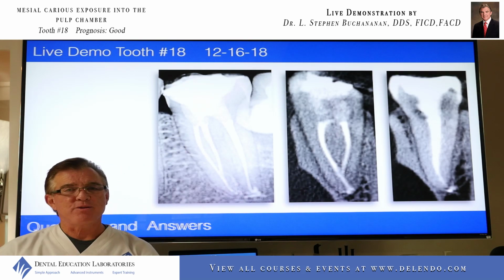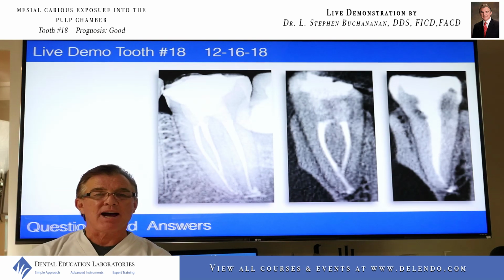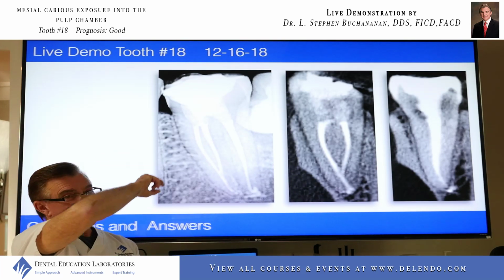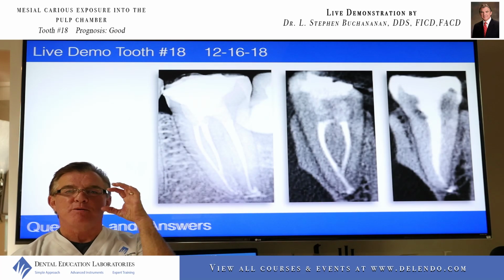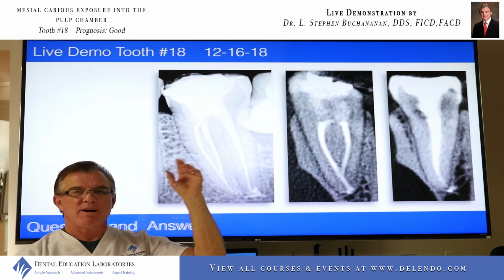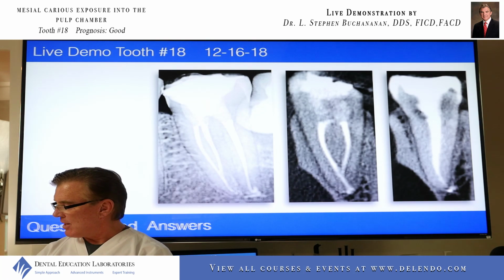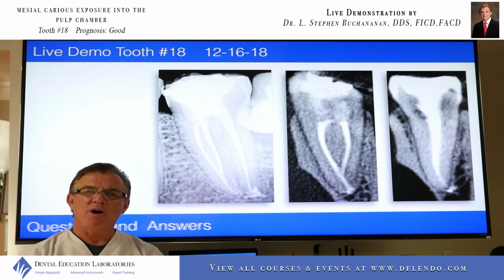The reason everybody's wearing 3D glasses is because it looks like you're having crossed eyes if you don't have 3D glasses on when it's being presented as 3D. So everybody wants to watch the image either here or on my monitor. You just wear these little thin Polaroid clip-ons. They flip up. The only problem with those is you have to make sure you don't wear them outside the office. You'll look like a nerd. But it's a remarkably simple system to use. It's a remarkably more relaxed way to operate.